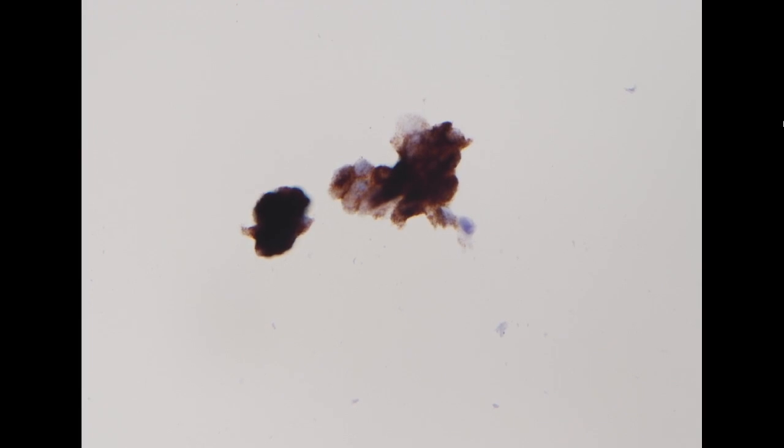So this is a follicular cell derived neoplasm. Based on the cytomorphology, this is an oncocytic tumor. So we will sign out the case as TBS category 4, suspicious for a follicular neoplasm, oncocytic type.